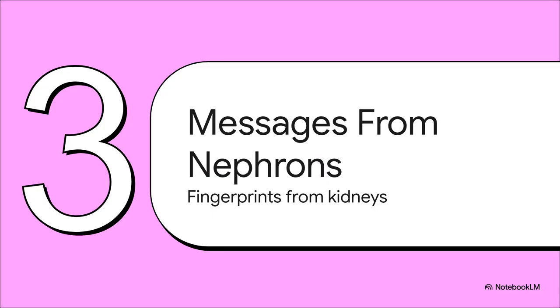We're going deeper now, right into the kidney itself. And this is where we find one of the most important clues in any sediment analysis, casts. I want you to think of them like molds, or fingerprints even, that are formed right inside the kidney's tubules. What's so amazing is they give us a direct message, a little postcard, about what's really happening inside the nephron.